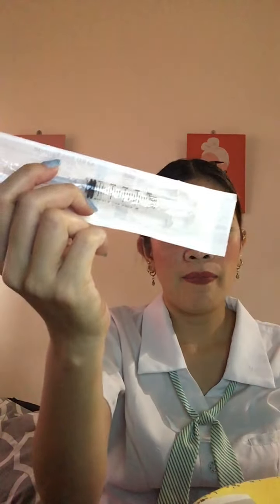So in continuation of our return demonstration on parenteral medication administration, the equipment that we need to use are the sterile syringe, needles, ampules or vials. We don't have available ampules. We only have the vial, and then the sterile gauze swab, or you can also use a sterile towel.